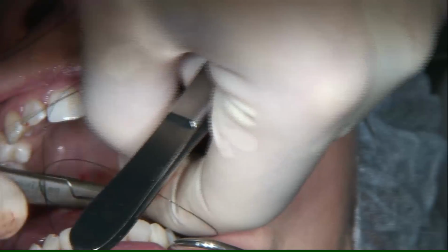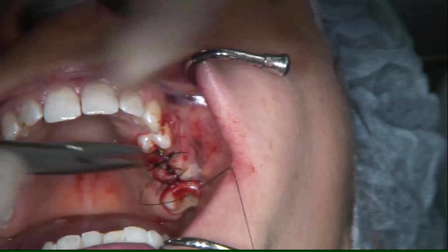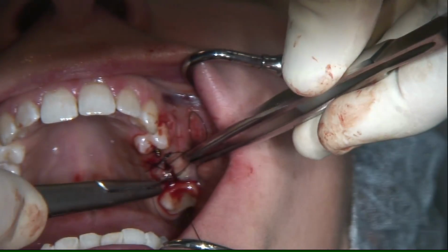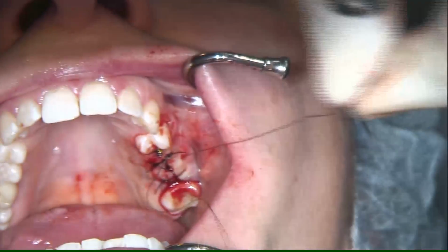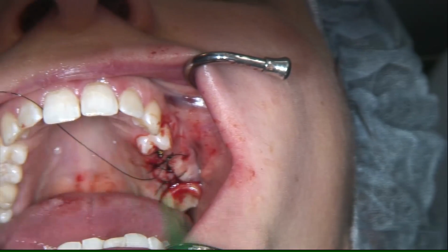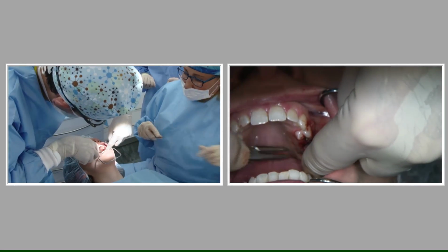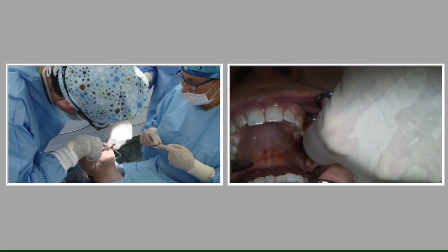It depends on the regeneration potential of the patient. So each experienced surgeon knows that when we are working with the bone substitutes, it depends on the regeneration potential of the patient if we have a full osseointegration or only a partial integration of the augmented bone substitutes. This may also have influenced this case.